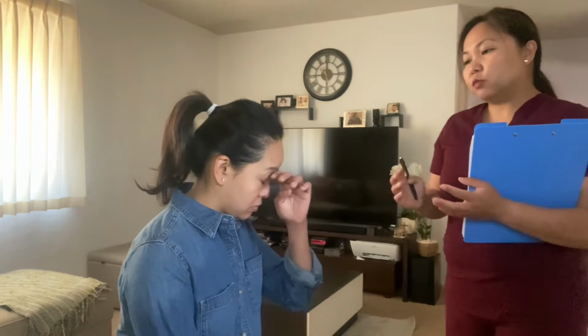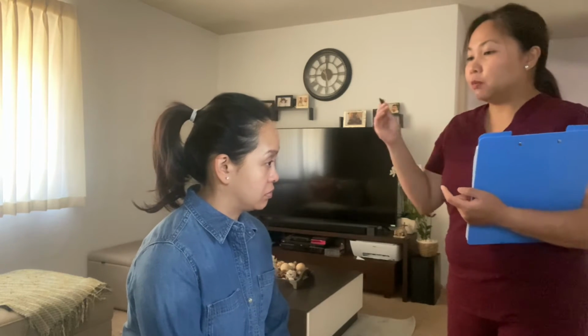So today I will be doing an eye assessment for you. I will be having you do some different positions, and I will be directing you to follow my instrument, or I will be putting some light on your eyes as well, okay?